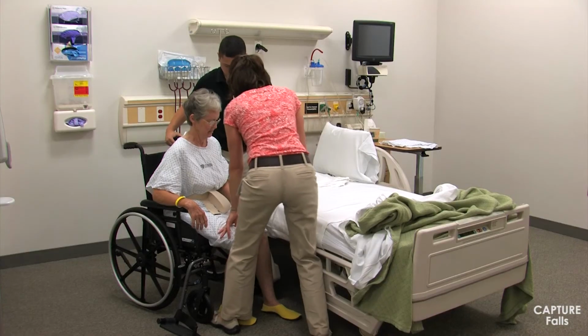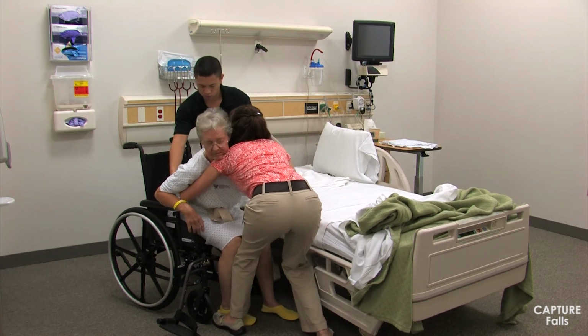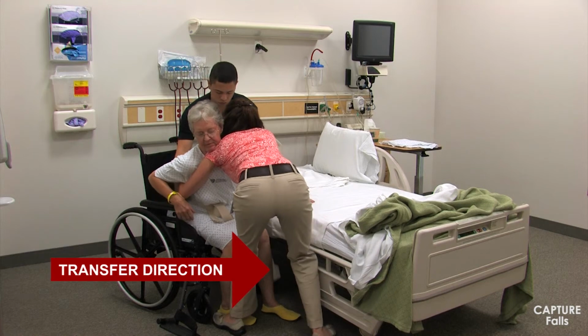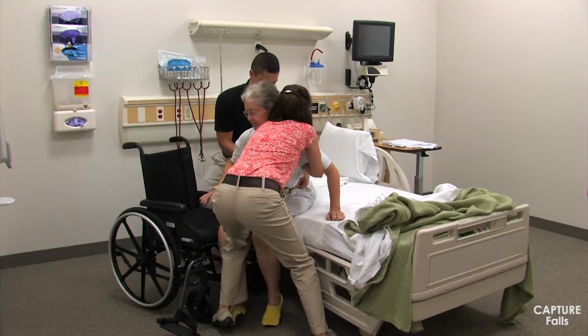If the patient has one leg that is stronger than the other, it is helpful to have the patient transfer towards their stronger leg. For example, if the patient has right-sided hemiparesis following a stroke, ideally the bed that the patient is transferring toward is on their left side. The transfer will be easier if you transfer towards the patient's stronger side and thus safer for you and the patient. Of course, if the patient transferred towards their stronger side going to the chair, recognize that on the way back they would be going towards their weaker side.